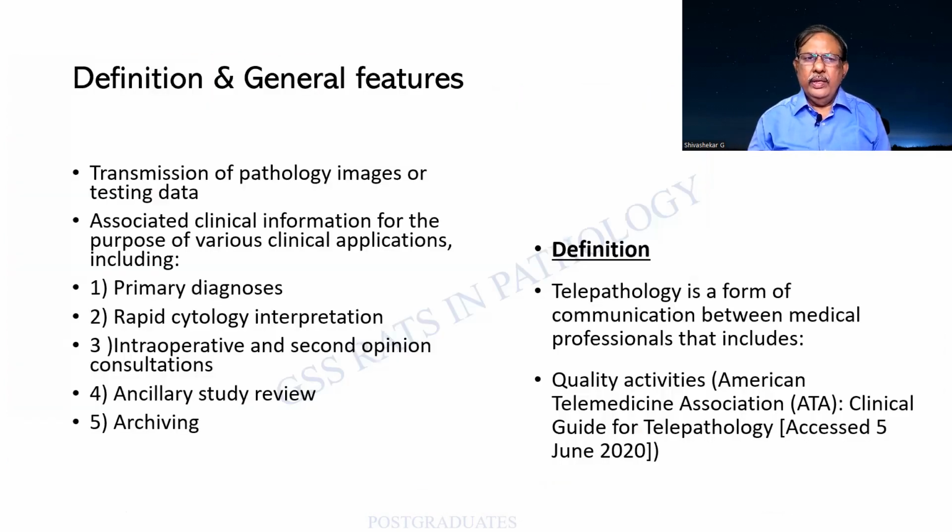Coming to telepathology. What is the definition? It is a form of communication between medical professionals that includes a transmission of image or data. It can have different forms of clinical applications, including the primary diagnosis, rapid interpretation of cytology, intraoperative, and second opinion.